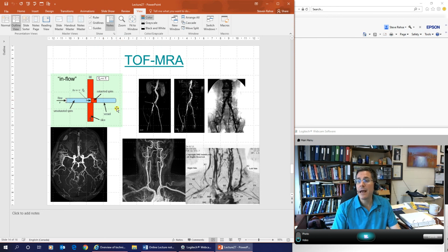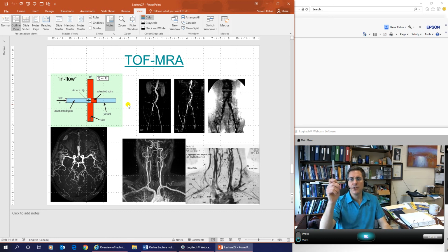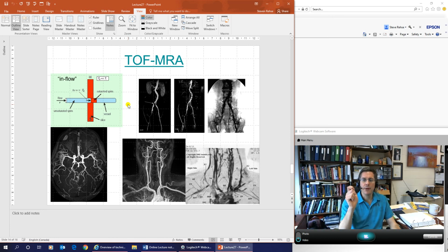So you have to think back a couple lectures. We talked about spin saturation. What happens when you start off your experiment, the pi/2 pulse bangs them over. You wait some time TR for the spins to recover, bang them over again. And we said if you don't wait long enough, bang, and they start to recover, and then you hit them with another pi/2 pulse, nothing happens. They have to be fully recovered to get that spin flip. If they have not recovered all the way, we call that spin saturation.